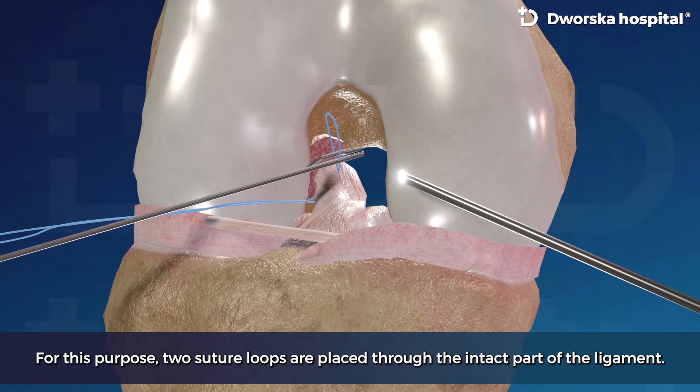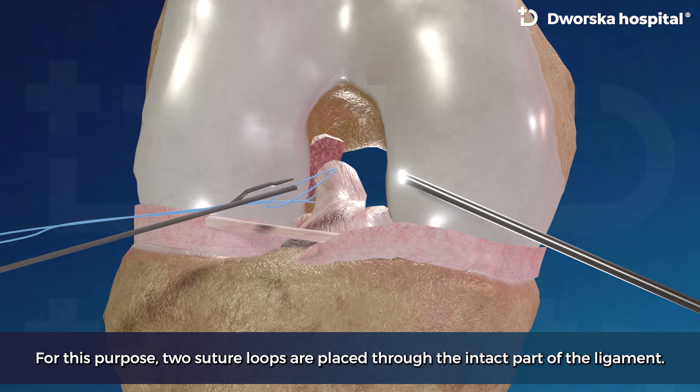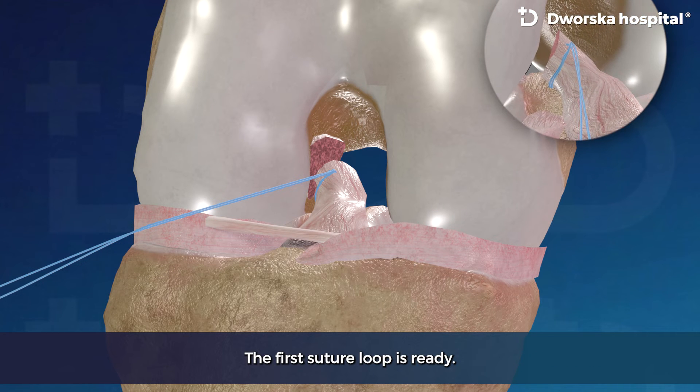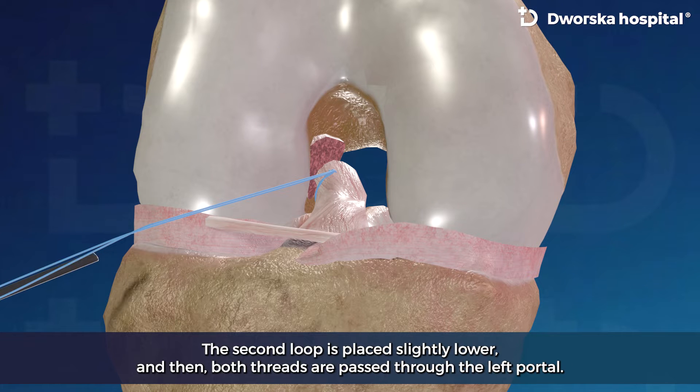For this purpose, two suture loops are placed through the intact part of the ligament. The first suture loop is ready. The second loop is placed slightly lower, and then both threads are passed through the left portal.